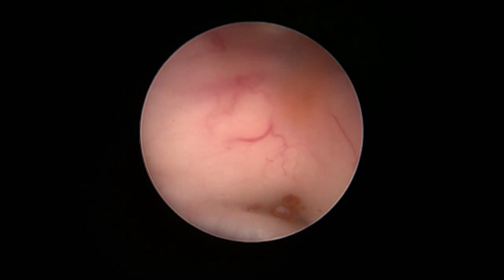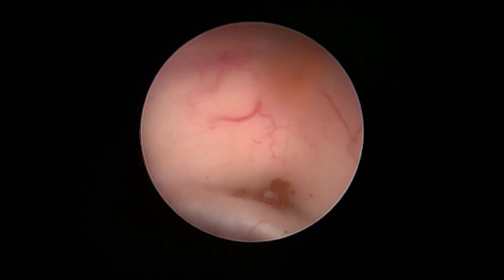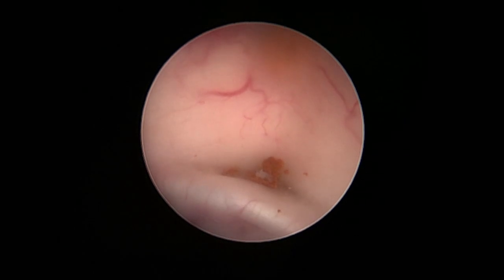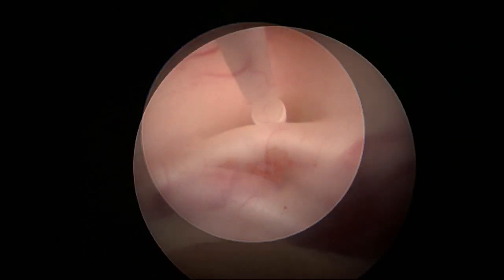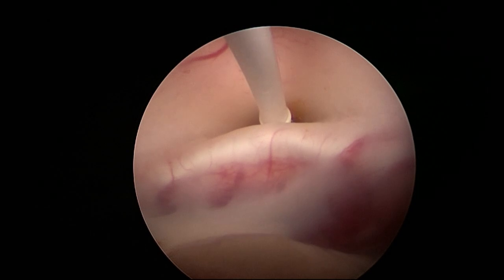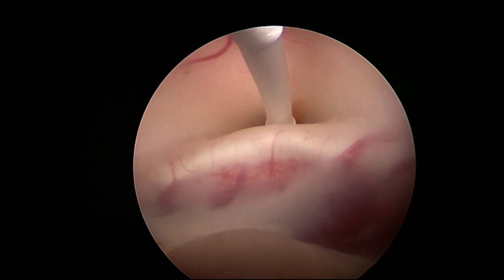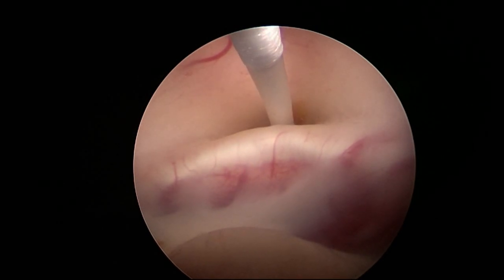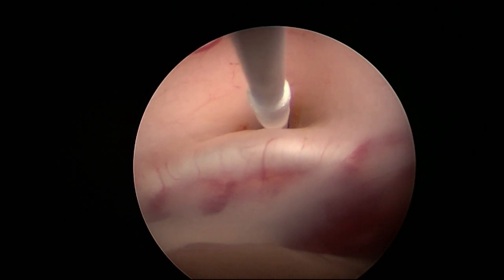On reaching the third ventricle, one can recognize the completely closed entry to the aqueduct and, in front of this, haemosiderin remnants. The closed aqueduct is carefully perforated with the Fogarty balloon catheter.